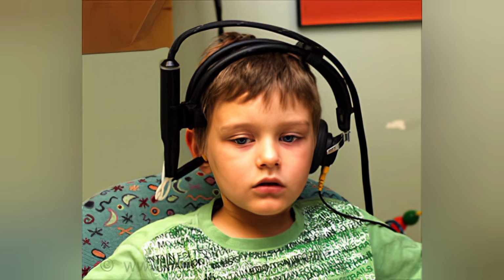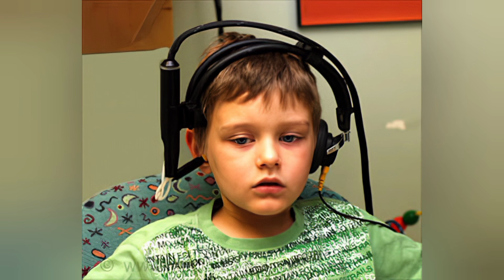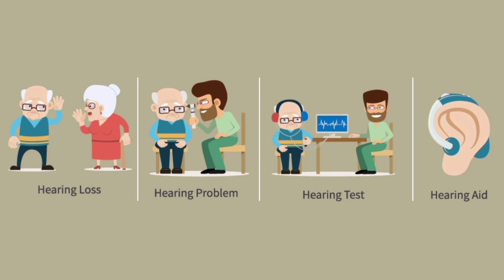This test is mostly dedicated to children having problems with speech impediment, ear pain, frequent infections, mouth breathing, snoring, or sinus obstructions and hearing loss. So it is definitely a very helpful tool for people who have problems with hearing and speech. It gives a way towards the right treatment for the problem, which can make the patient's life more comfortable.